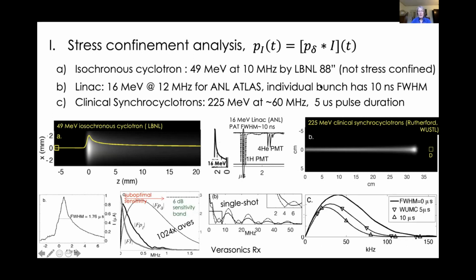And when we look at the spectral content of a pulse delivered instantaneously in thick black, as opposed to delivered over a 5 microsecond or a 10 microsecond pulse duration, we lose a little bit, but nowhere near as much as we lost in Berkeley. So we're pretty close to stress confined, and I'll take it. As an experimentalist, I'll take that.